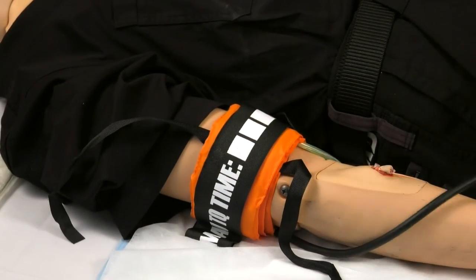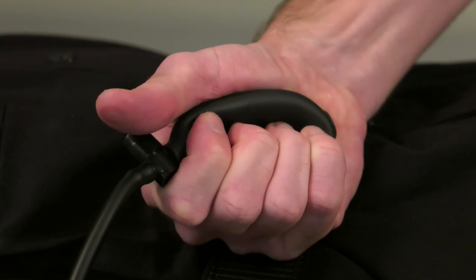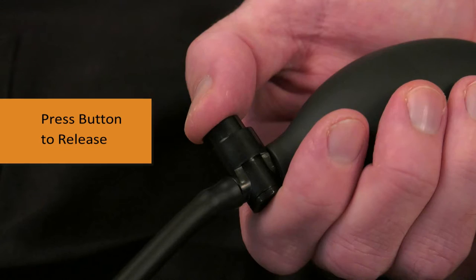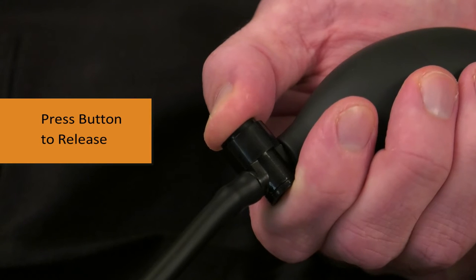Simply squeeze the bulb to inflate the cuff to apply enough pressure to arrest the bleeding. If for any reason you need to remove the cuff, you can simply press the button to release the pressure and release the velcro strap.